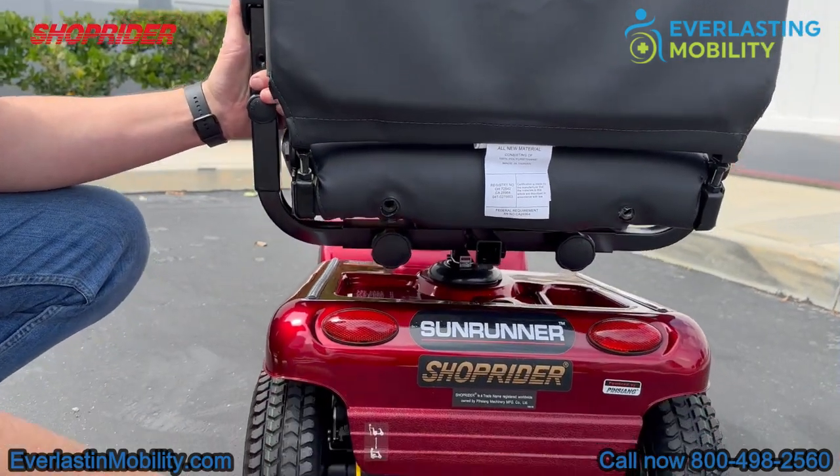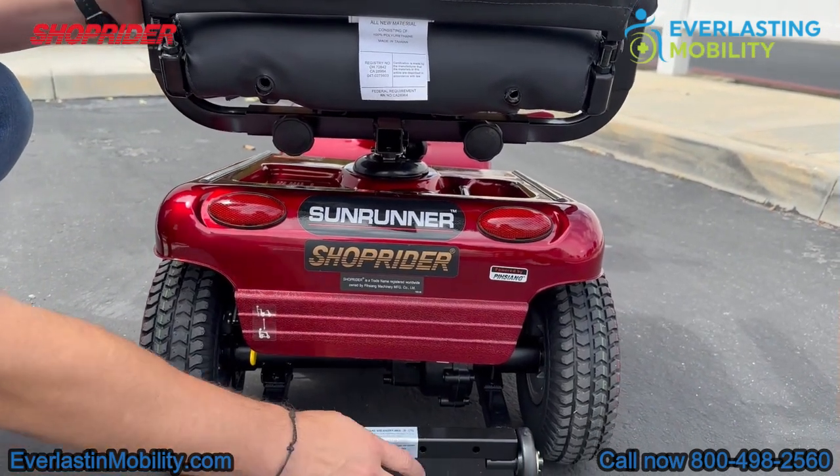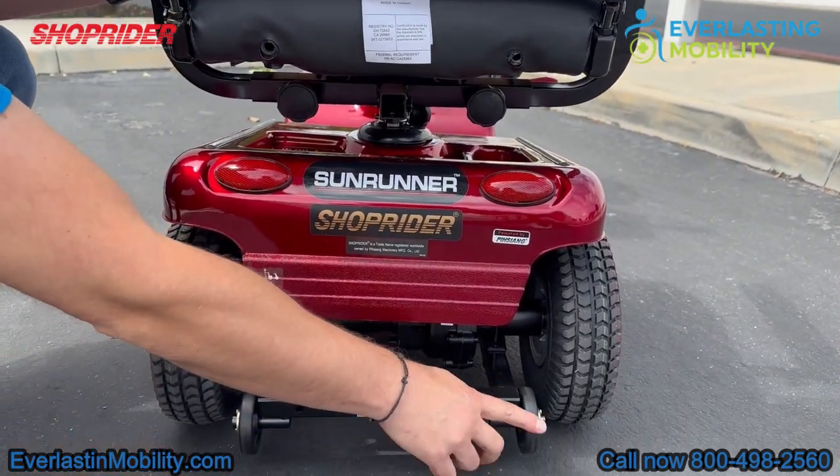At the bottom, these are the anti-tip wheels. They're there for added safety — if you're going up a steep incline, they prevent you from tipping backwards.